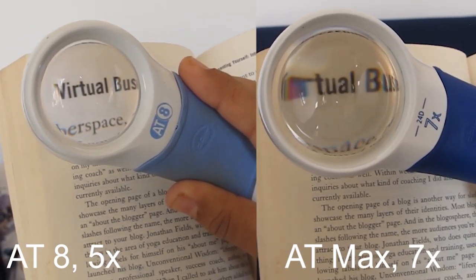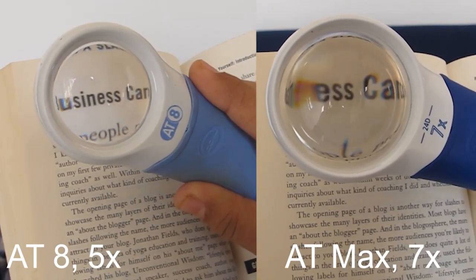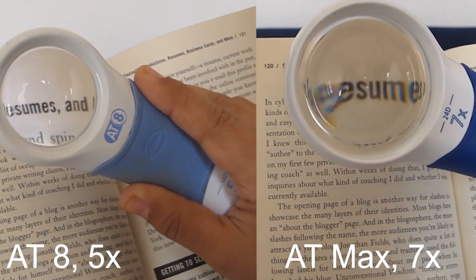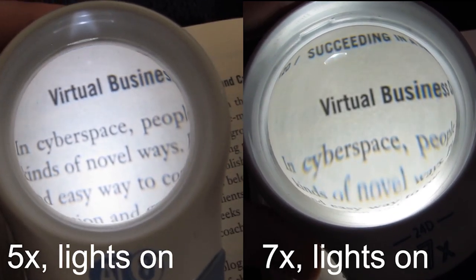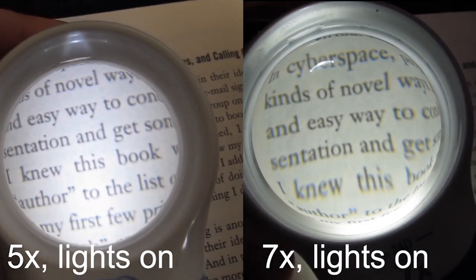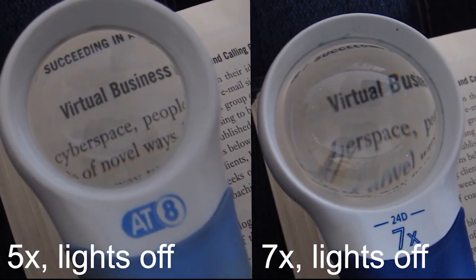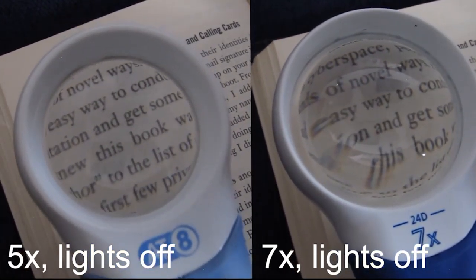Here I just wanted to show you clips of the magnifiers in action. It is a little bit tricky to film them, so keep in mind that it's a lot better in real life. Here they are with the lights on. And here they are without any light — you can see that they're still pretty clear.